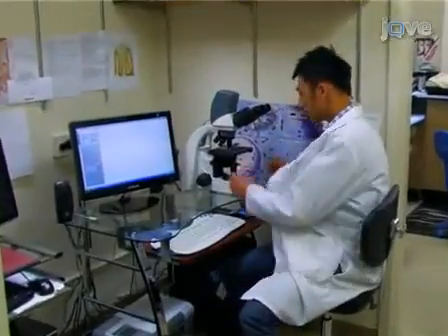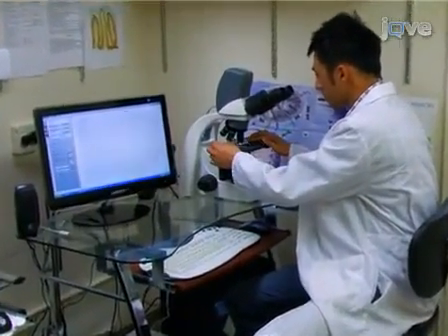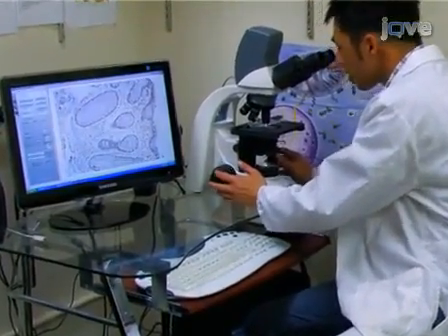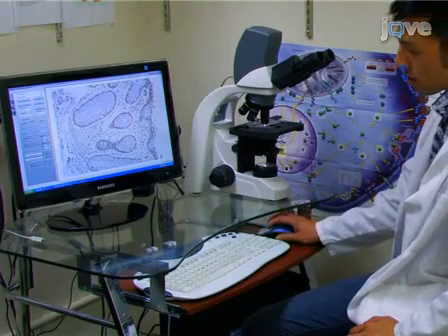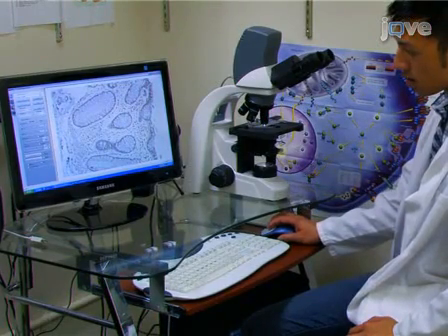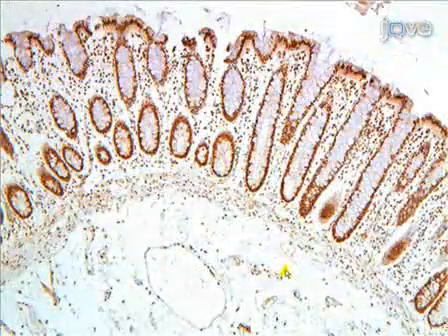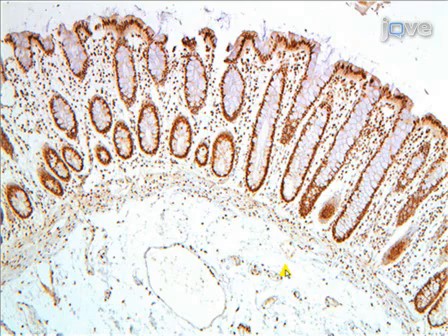We also use immunohistochemistry to determine the frequency of crypts deficient for Ku86 and CcOI. On this slide, Hoi Nguyen will go through an entire tissue section obtained near a colon cancer and immunostained for Ku86. We see that a few crypts are deficient for Ku86 in this cancer-associated tissue section.